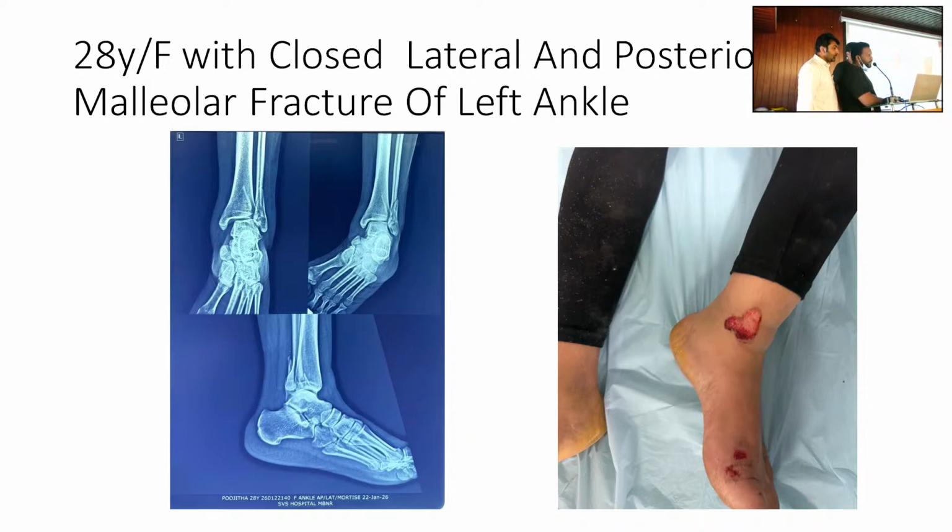Medial joint space of the ankle is increased, sir. So is it abduction or adduction now? Medial joint space increased now. The foot has gone abduction or adduction now? Adduction it has gone, sir. Adduction how? Talus has moved towards the lateral side. Yes, sir. The gap on the medial side.